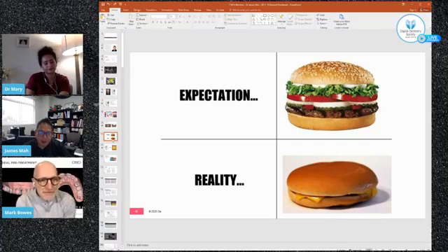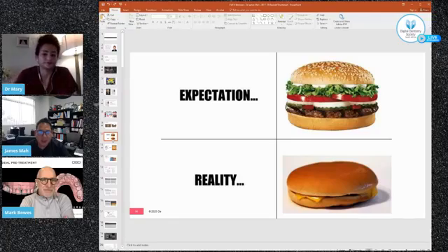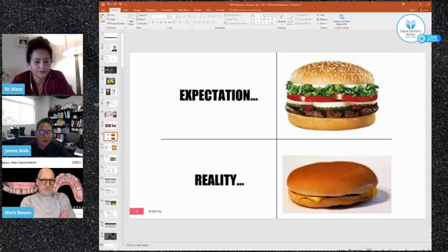You're completely correct. I didn't mention, but one of the other hats that I wore in the past is I was an investigator in orthodontic complaints to our state dental board. And in orthodontics, the highest number of complaints arose out of clear aligner therapy. A lot of them had to do with the clinician having no plan. In other words, they gave the patient the fee and an estimated number of steps. But then when things went wrong, and when you looked at the goals, they were unachievable. So, of course, there's no outcome, and that leads to dissatisfaction and the complaints.